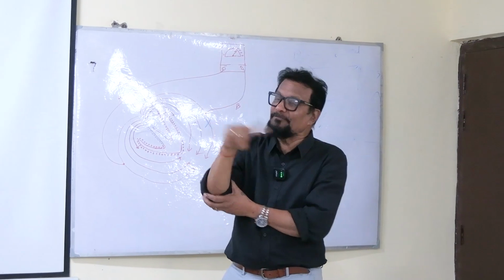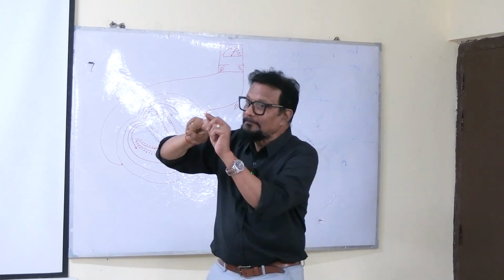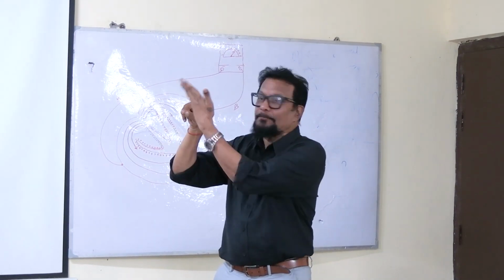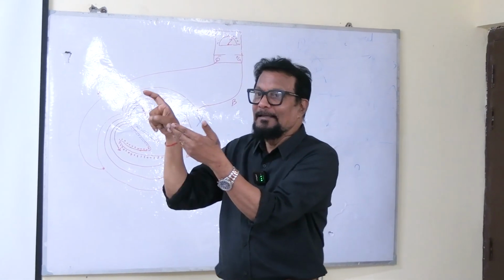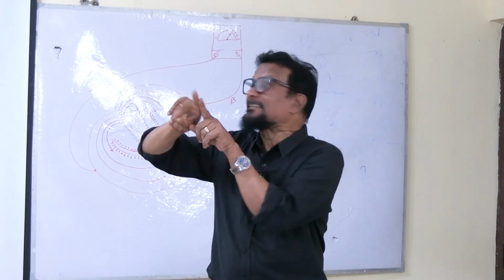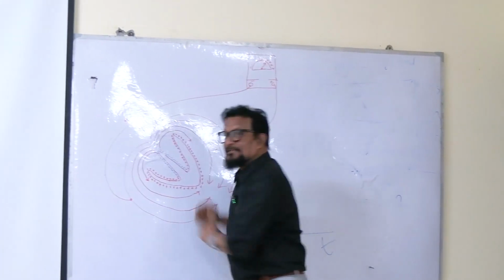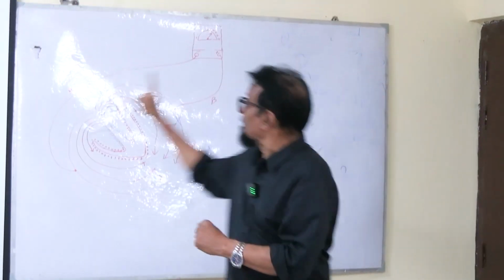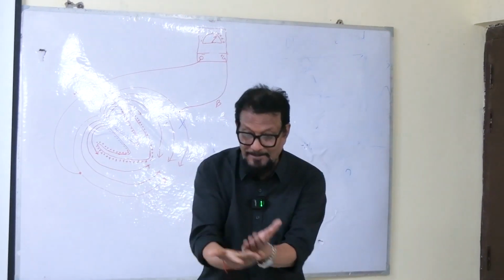Okay. Now, this deflection, this pointer may have a pen, so this movement can be recorded on a paper, isn't it? So this movement, this change in voltage difference between two regions can be recorded. This voltage difference can be recorded by the galvanometer, in this machine, on a paper.